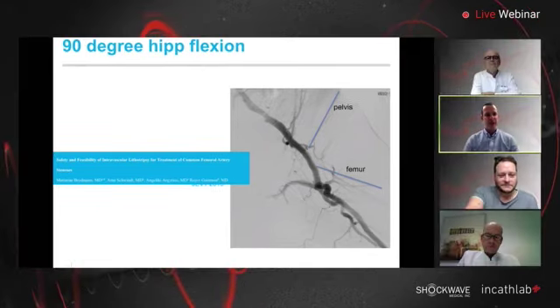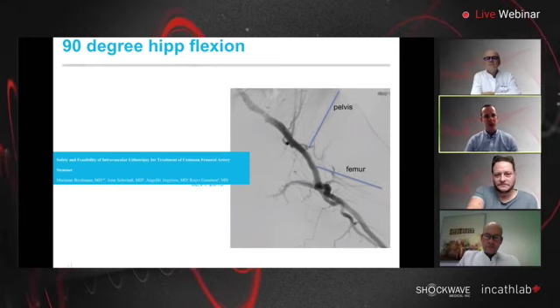It's a very, very impressive case, especially the comparison between the two technologies, where the little drill, the orbital one, tried to scrape this kind of very calcified surface. So essentially, what's nice also, the two devices are working in a very different way. One is just trying to scratch this stone, and the other one is breaking the stone, and then helping with balloon afterwards you can get these results. Very impressive, especially on one side you were able to expand the stent perfectly. The Supera, on the other one, there was not even need of a stent.